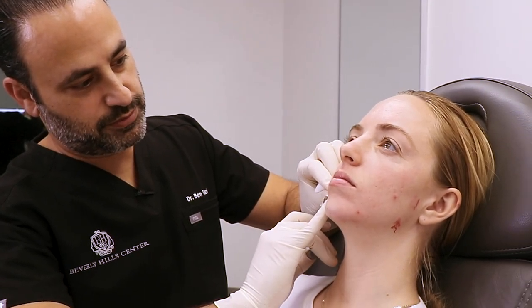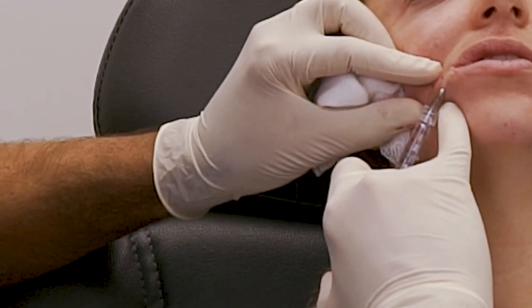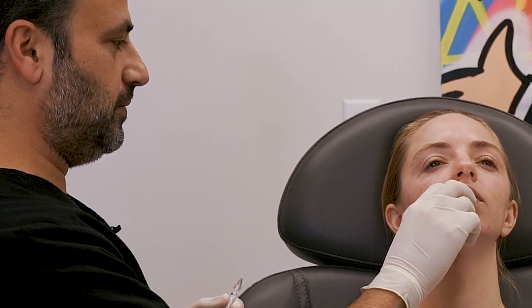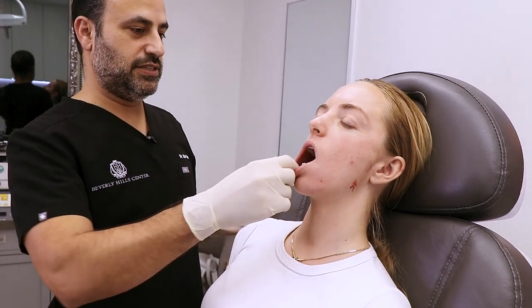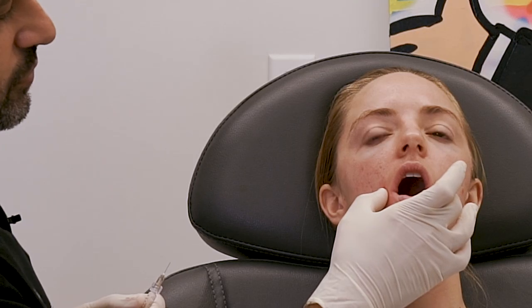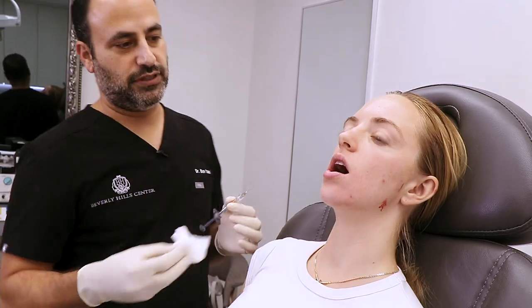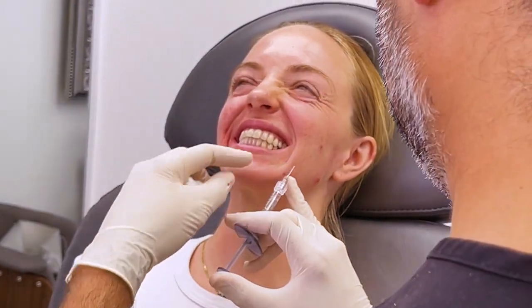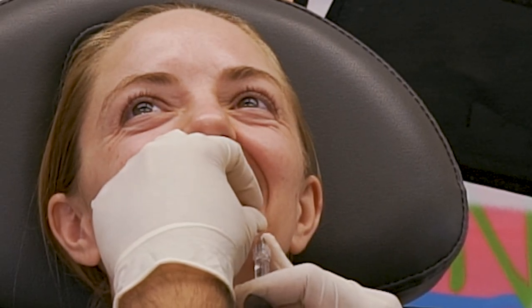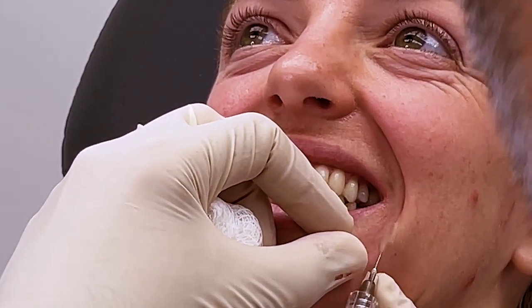Going to come back and make her look like a happy person. We're pushing up the depression on the corner of the mouth going up to the chelion. Don't want to go too strong because she has a strong modiolus — the group of muscles that comes into the corner of the mouth. If you feel too much around there, the filler is going to go into the muscle and make it bulge more and she'll look masculine. You have to go very gentle. I'm going to start in the crease while she's smiling because I can get to the base of that line.